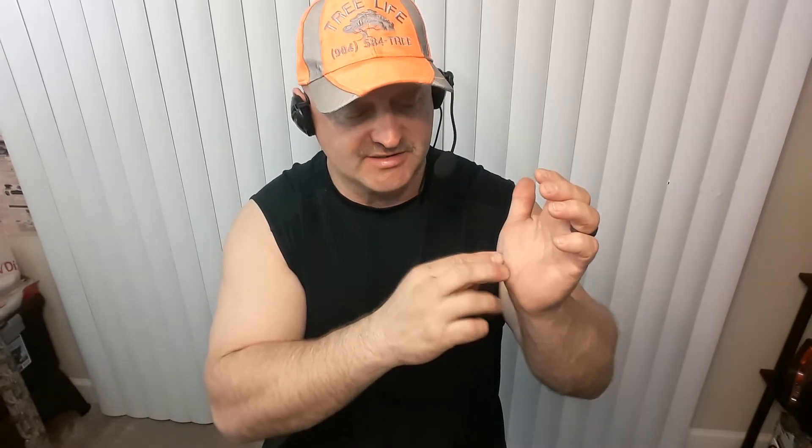I've had two places of deep soreness and deep tension. The muscles were so tight and the tendons were so tight — it was almost like a trigger point. There was another area at the top of my calf on the corner where the other attachment is, and that was very tender and sore to the touch. Basically they hit the heel and that area right there where most of the tension was. It's kind of painful at first because they hold it on that point.